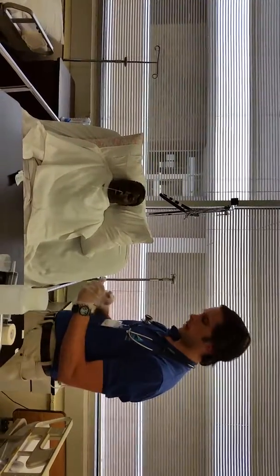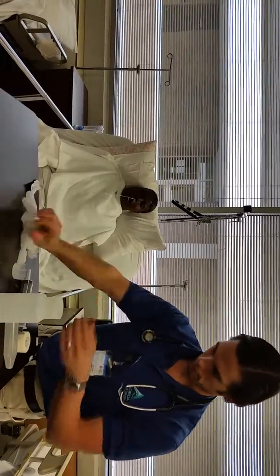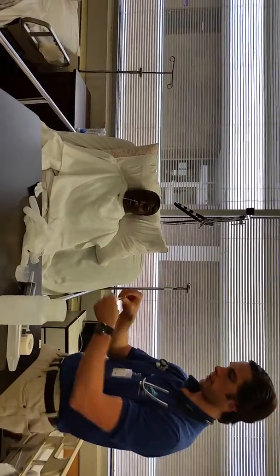Now I'm going to anchor the NG tube to the patient's nose. I pre-ripped some tape.